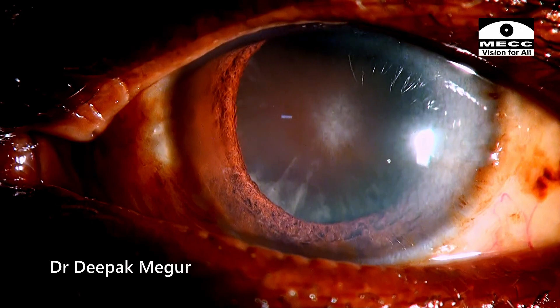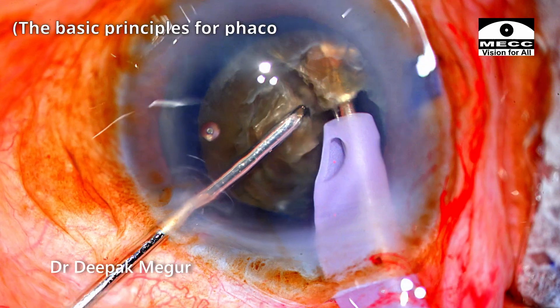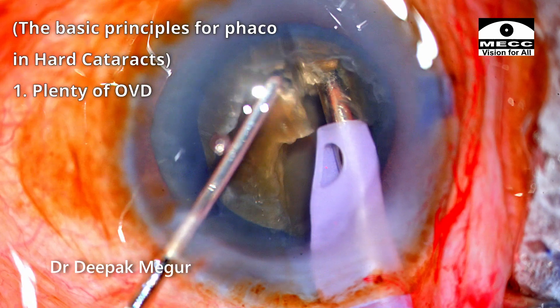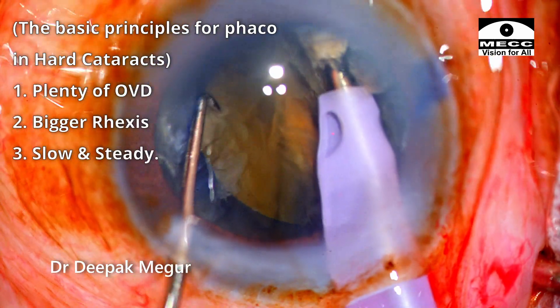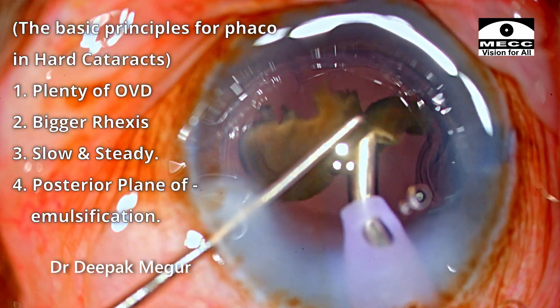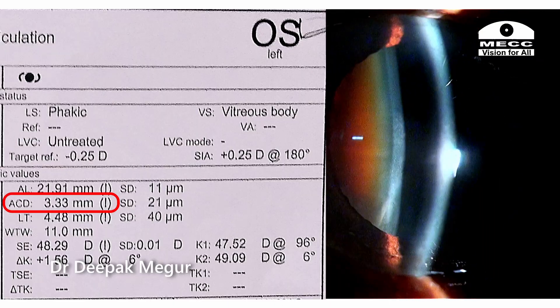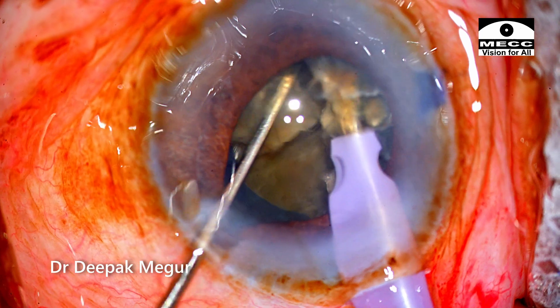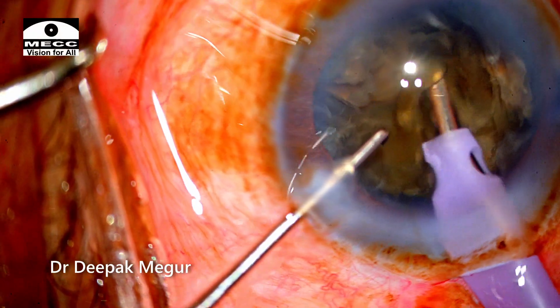To summarize: in such cases one may certainly go ahead with small-incision cataract surgery or extracapsular surgery if one wishes. But with the right game plan, the right technique, and most importantly patience, you can also conquer this dense cataract by phacoemulsification without compromising endothelial health. The deep chamber in this eye was beneficial and gave me an opportunity to work away from the endothelium.